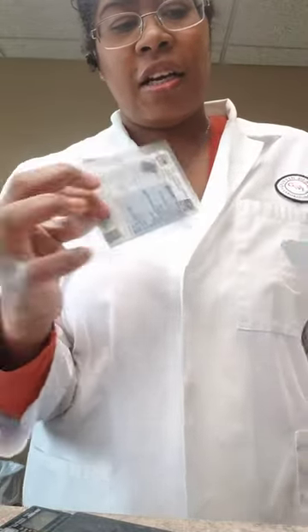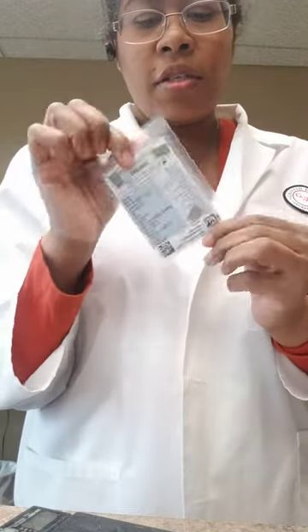I just want to show you guys this — I just got this in. We usually get them in via FedEx, but these are the alloys that we get. This one is from Argent actually, and we use different manufacturers of alloys.